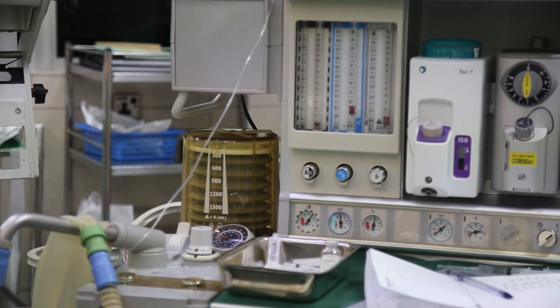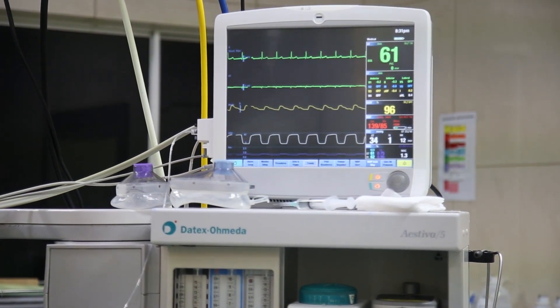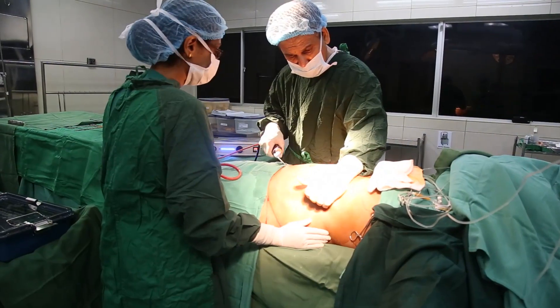If you consider the anterior abdominal wall, there are two halves — upper and lower. Each half can be measured to track how much fat is sucked out from each area, so equal amounts are removed. This suction process is done with a power-assisted micro air suction apparatus.